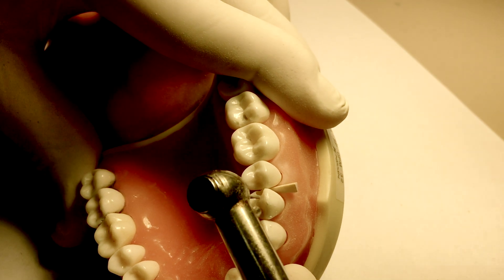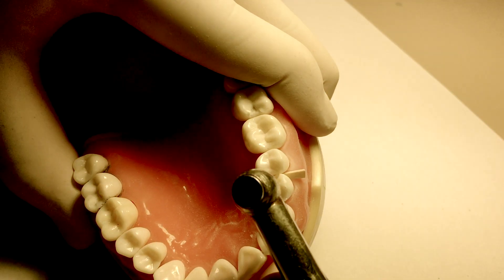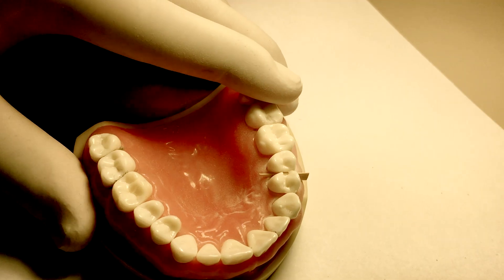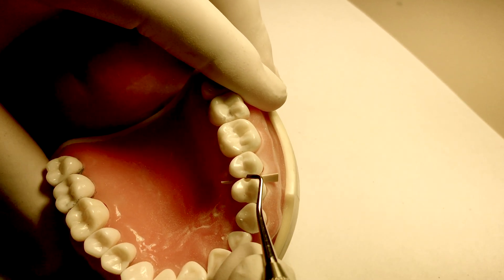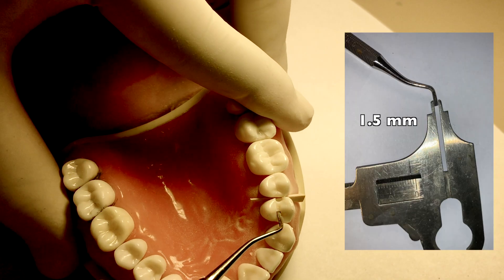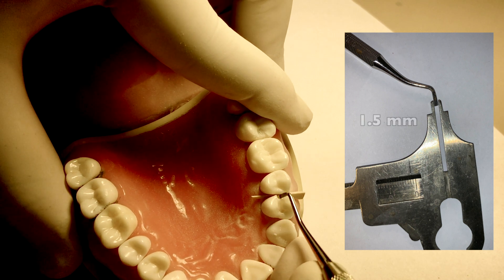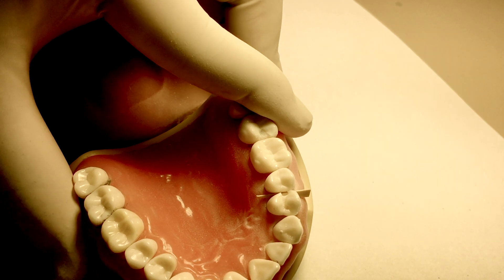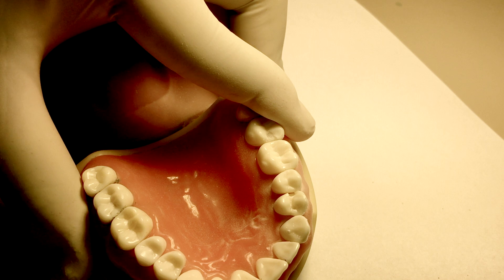There are numerous burrs that can be used in a class 2 amalgam preparation — a 245 or a 330 carbide burr can also be used. A critical measurement uses a hatchet that is 1.5 millimeters in width as a guide for the size of the isthmus, which should be 1 millimeter. The hatchet should not be able to pass through this portion of the amalgam prep.